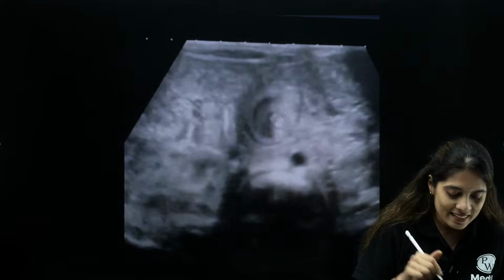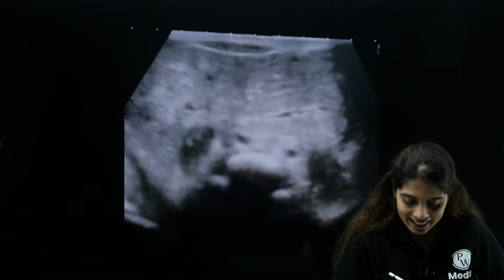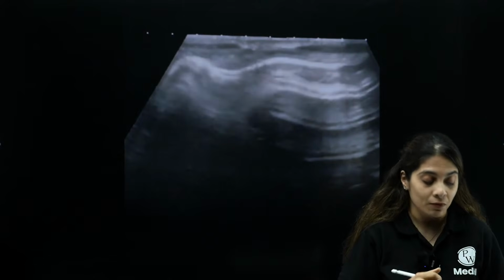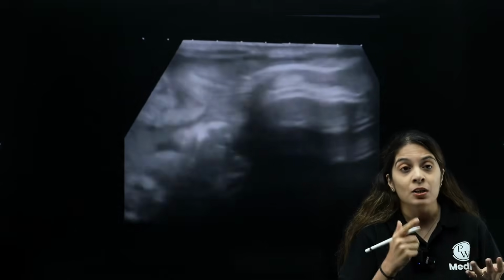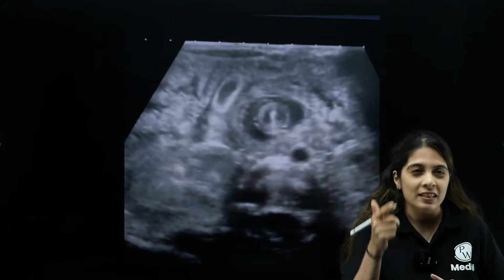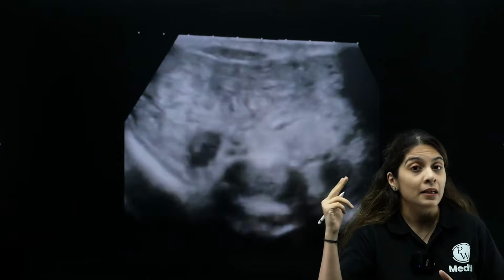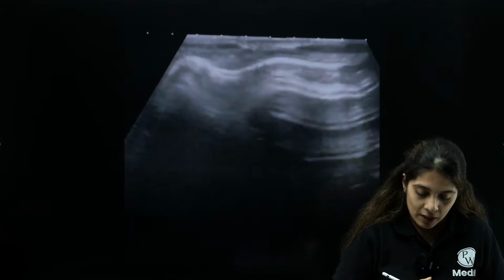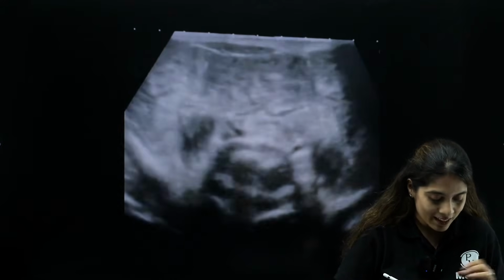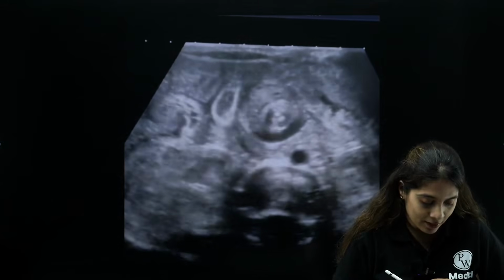You can see that there is some swirling type of motion in the epigastric region, right? Anyone want to comment? What could this be? Which sign of which particular pathology is depicted on the ultrasound? You can see that very nice swirling motion in a newborn presenting with recurrent bilious vomiting and abdominal pain. Please, someone answer this particular sign.